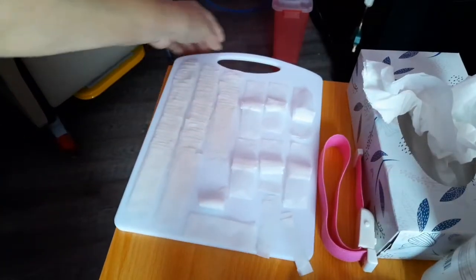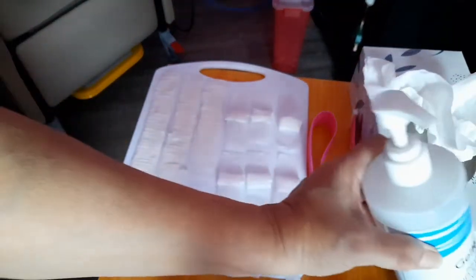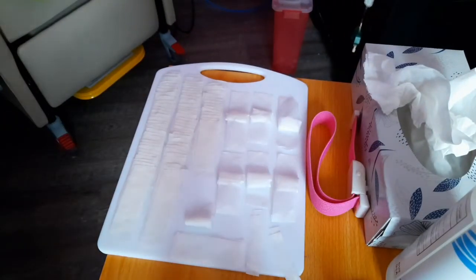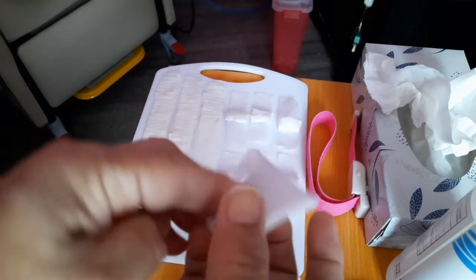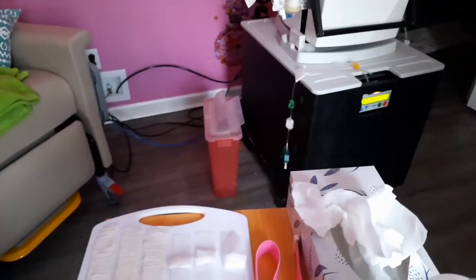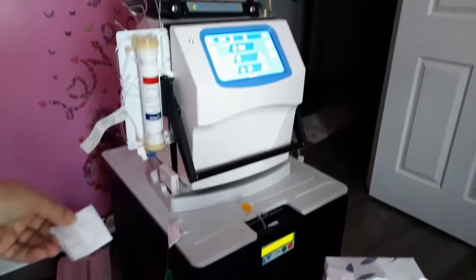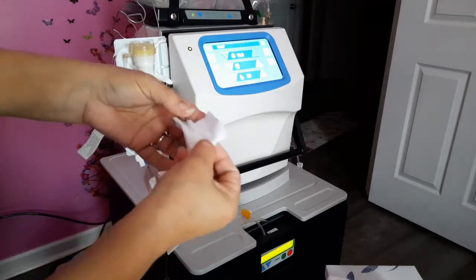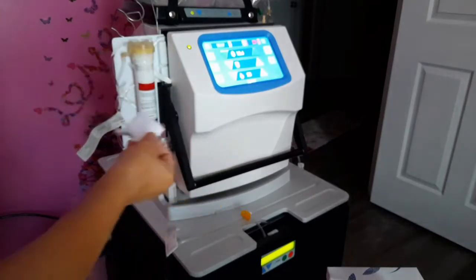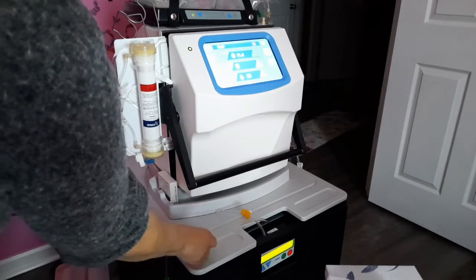I've got my gloves to put on so that when I go to insert, do the cannulation. I've got my tourniquet. I've got my hand sanitizer right here. Alright. Next thing I'm going to do is take a few gauzes and put them over here by the dialyzer side, because when Hubster primes the dialyzer, he's going to have to hold a piece of gauze on the end of it to catch any fluid. Otherwise, that fluid detection center is going to go off. All right, so I'm just going to lay that down right there.